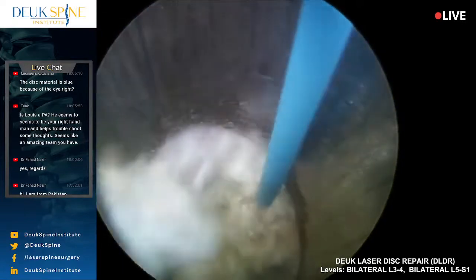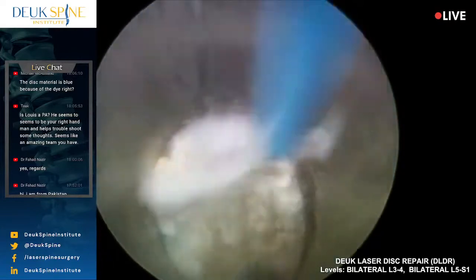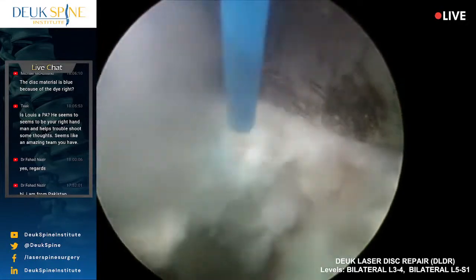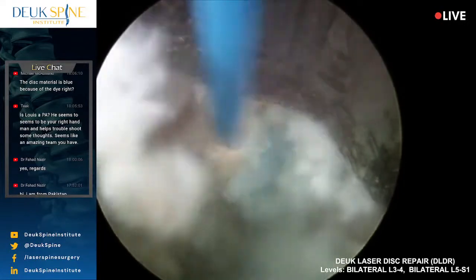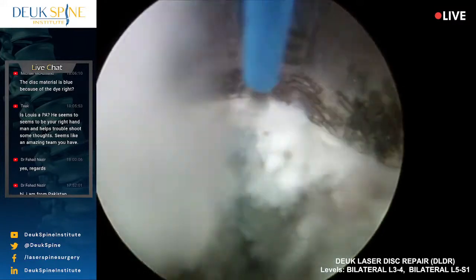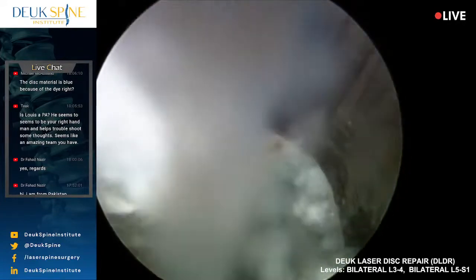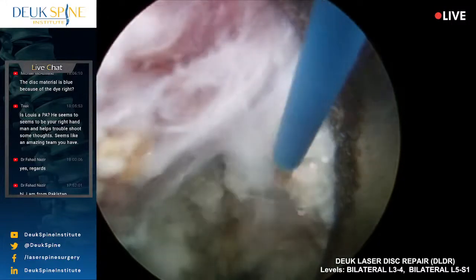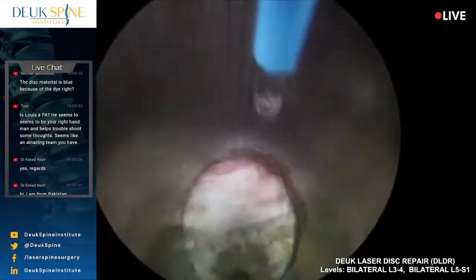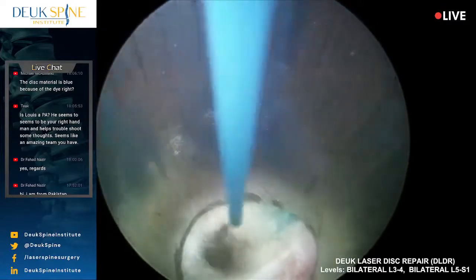Oh, we're finally pretty much done with this crazy disc. I may have used more energy on a disc, but I've never, ever spent as much time on a disc. That's for sure. But some are quick, some are long. You just have to be prepared to do what it takes, you know?